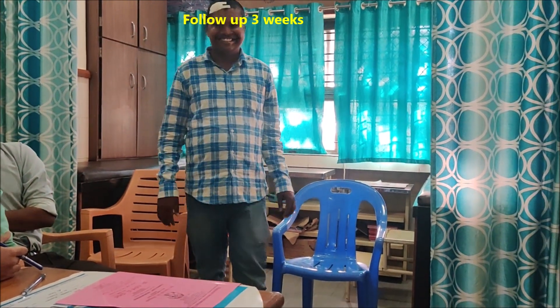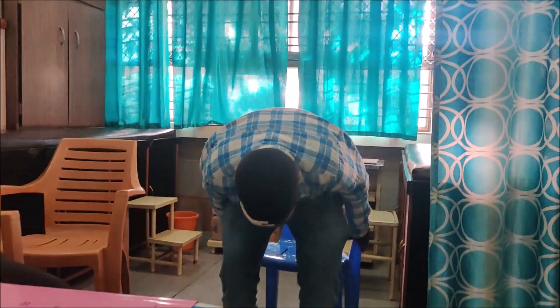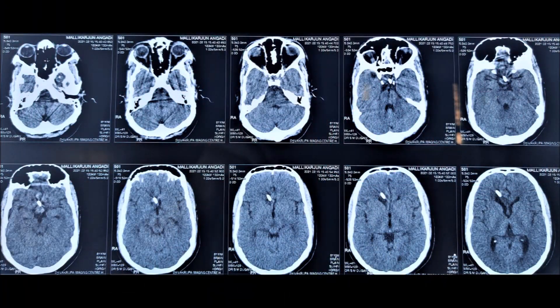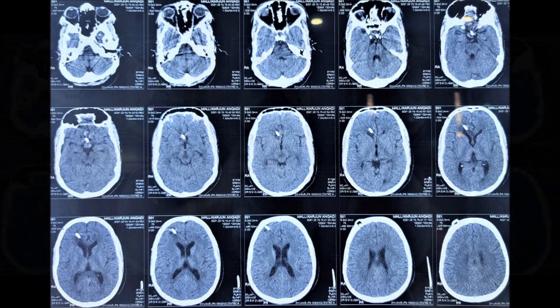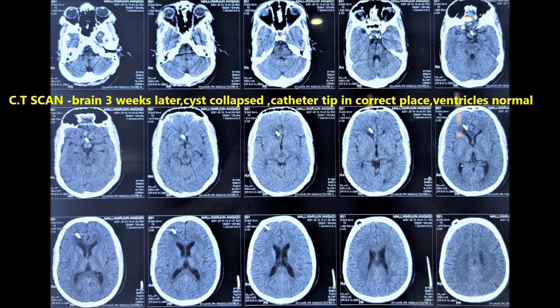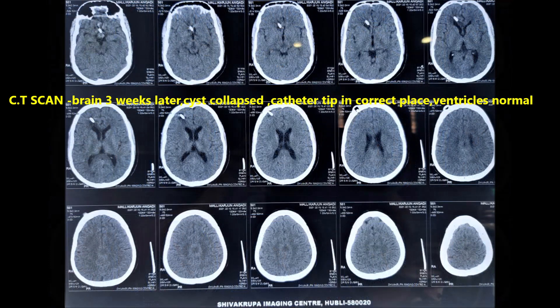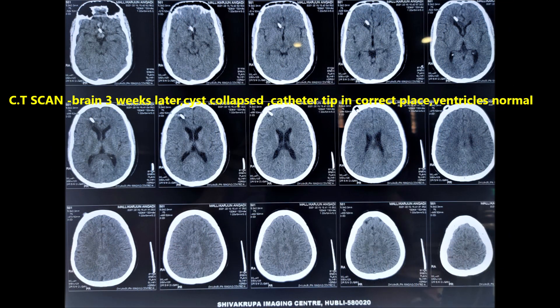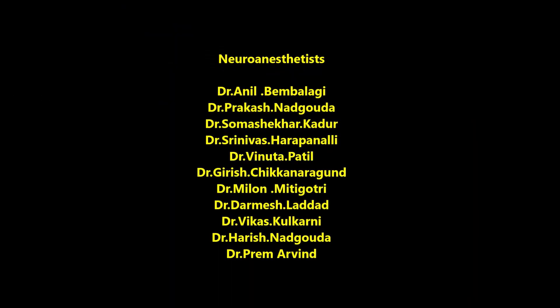This is his clinical status at three-week follow-up — independent, attending to his day-to-day activities and perfectly normal. The repeat scan at three weeks confirmed the cyst is completely collapsed, the catheter is perfectly placed in the cyst wall, and the ventricles are normal. He will undergo radiation, and post-radiation we keep repeating a scan every six months. If there is recurrence of the cyst, we keep aspirating.